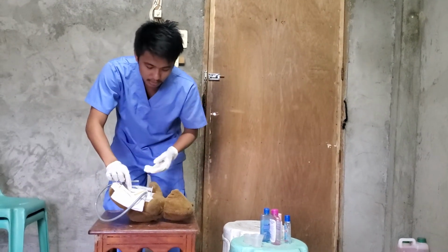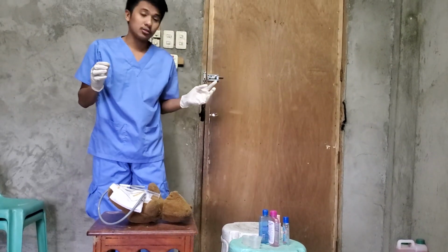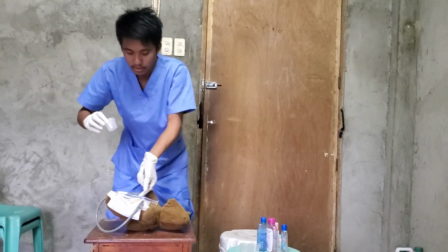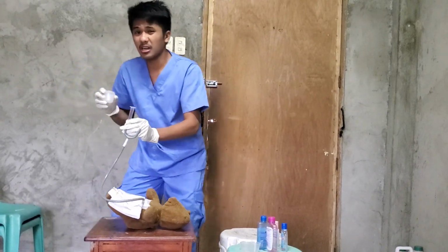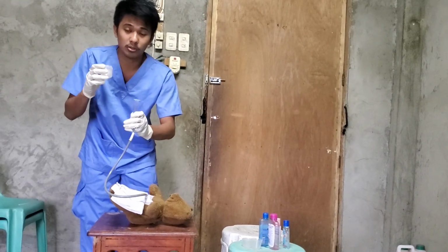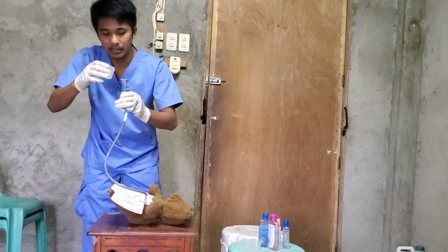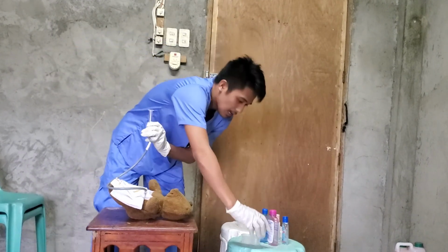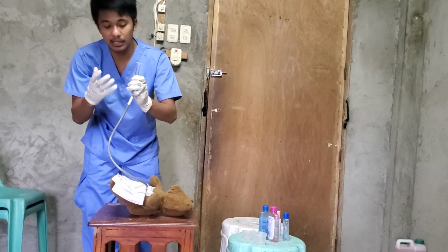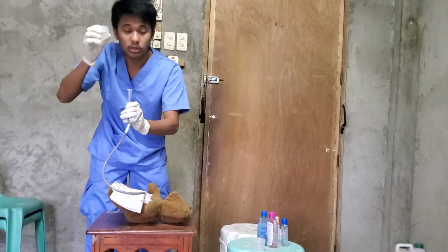Then the next step that you need to do is to administer the first dose of medication. So administer the first dose of medication. In administering medication, make sure the medicine is allowed to flow by gravity. So administering, then open the clamp. Then after administering the medication, flush again by using the water.